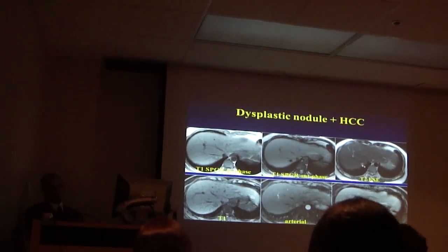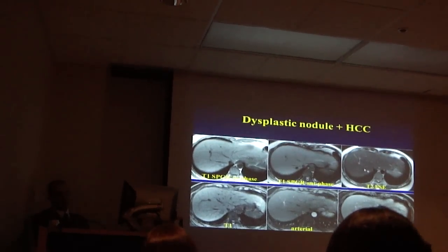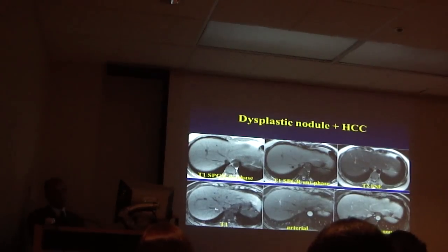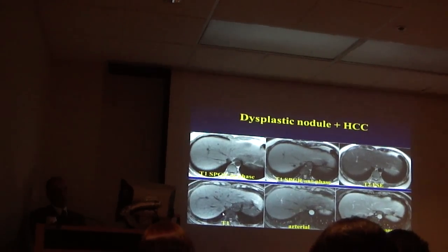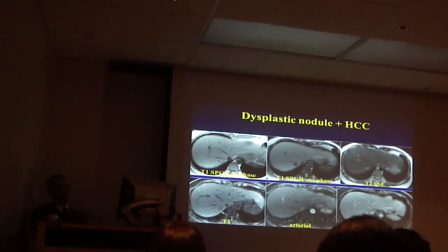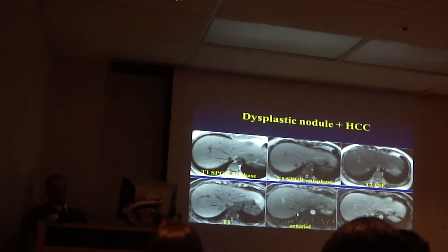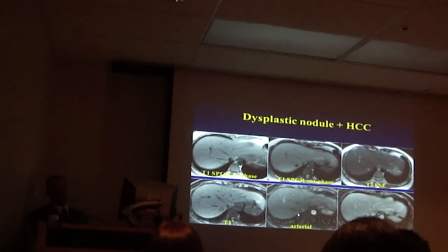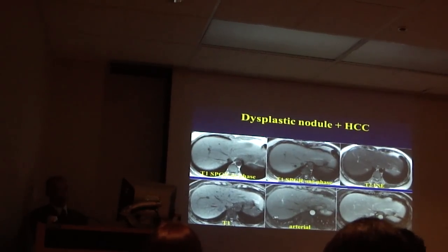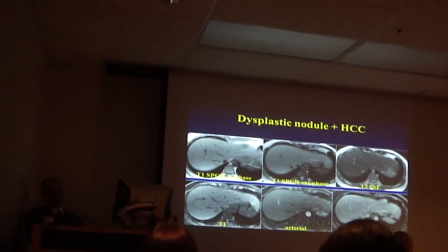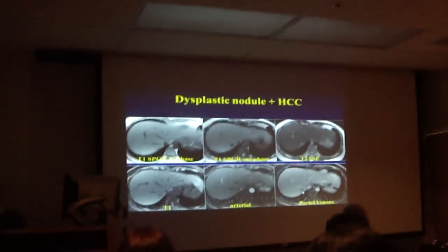On T2-weighted images you can again see the lesion. Look at the entire lesion — a part of it actually demonstrates enhancement on arterial phase. And the part that is demonstrating enhancement demonstrates washout.